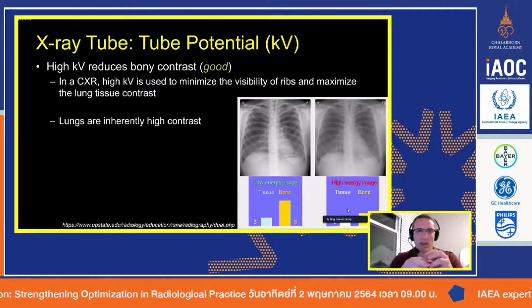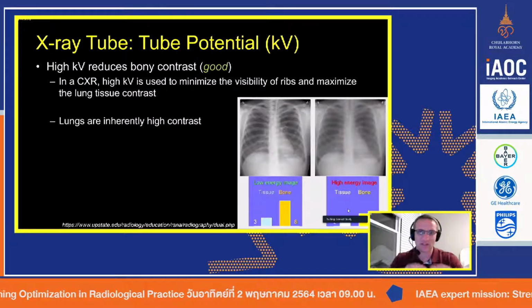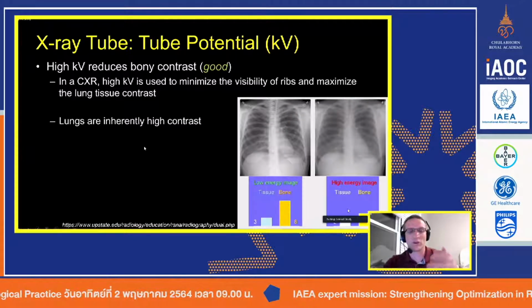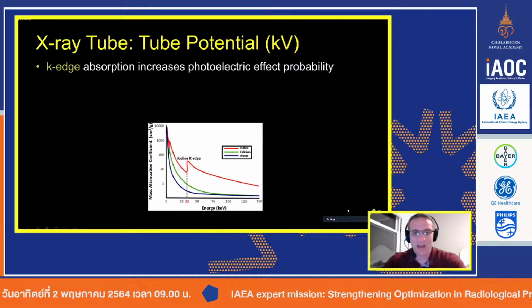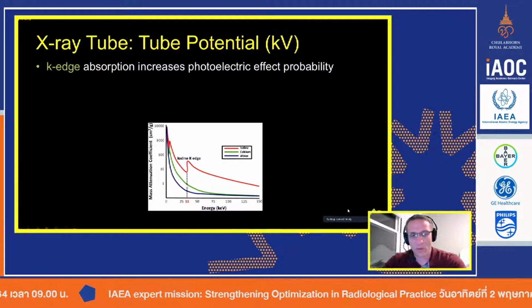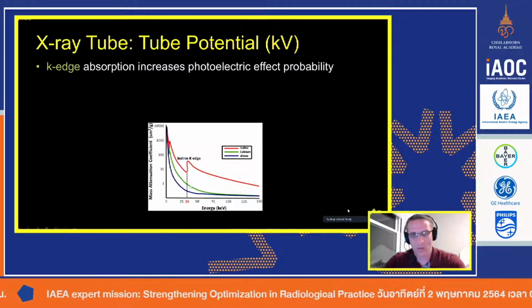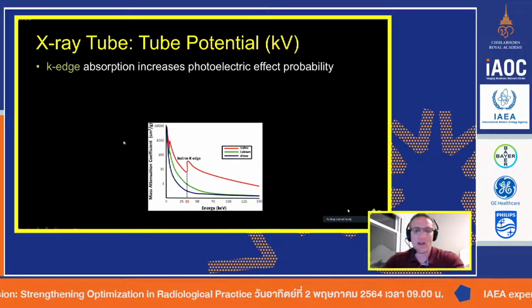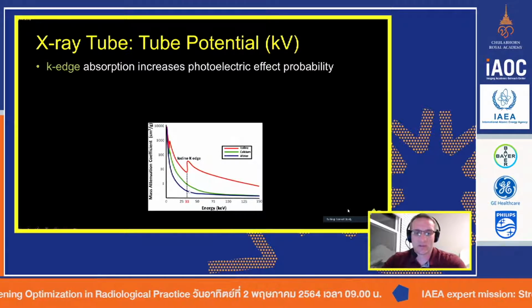But if there's maybe air in the colon or in the intestines, we want to be able to differentiate all that. And the only way to do that is to go to lower KVs. Now, we've talked about how the soft tissue and the bone, we want to image as best we can where those two curves are the farthest apart. You'll never get those two curves really far apart.